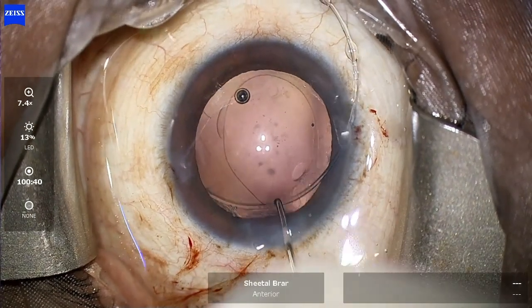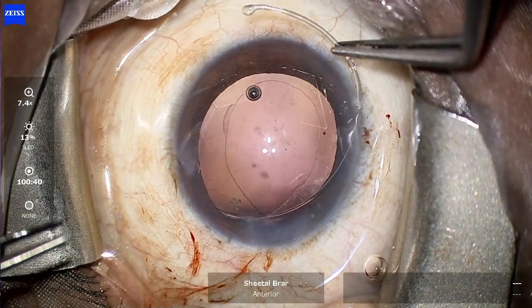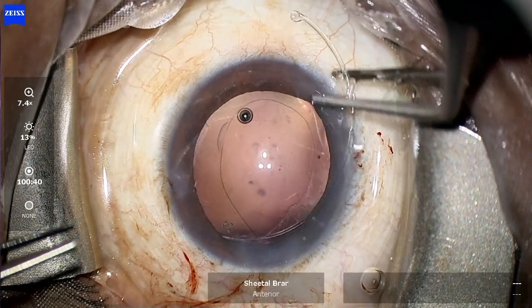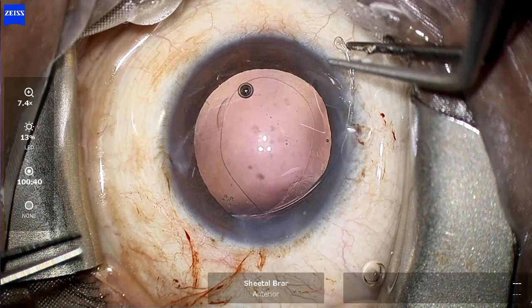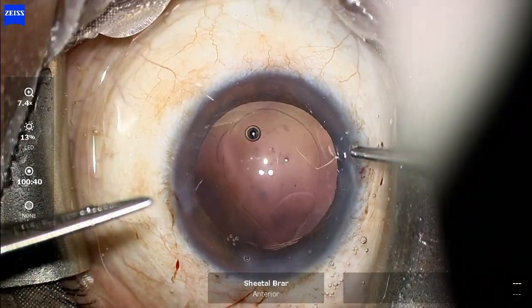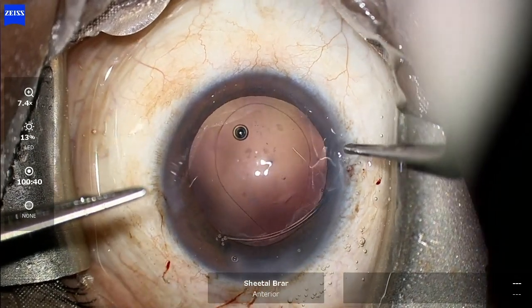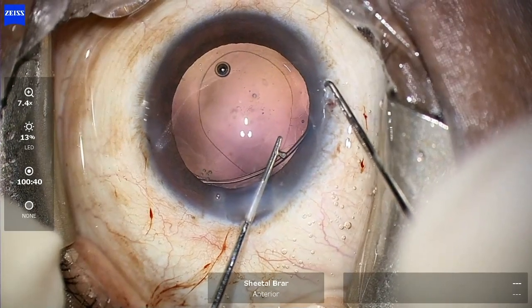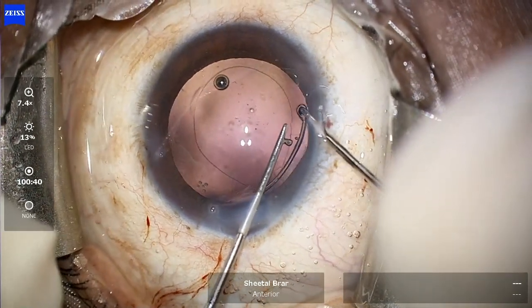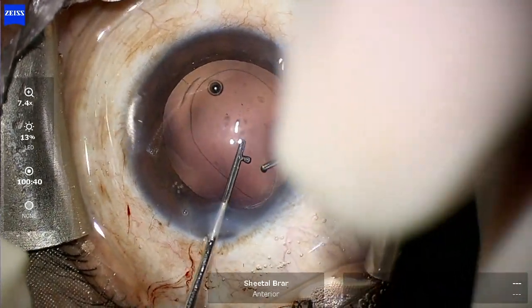I am checking the position of the CTR using a Sinski hook, and once I have confirmed the position, I am more confident in going ahead and dialing the CTR further. Once it comes close to the side port, I use a Sinski hook to engage into the trailing eyelet to gently release the CTR into the bag.